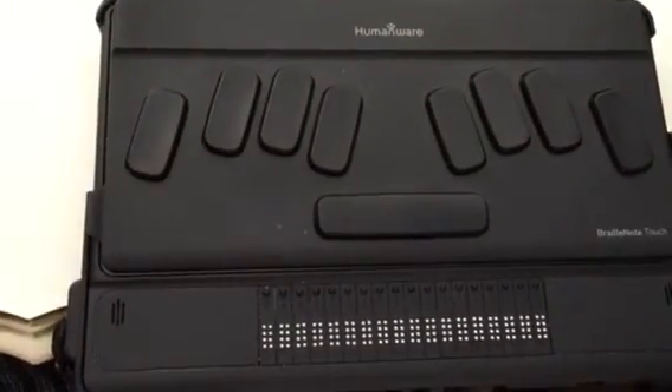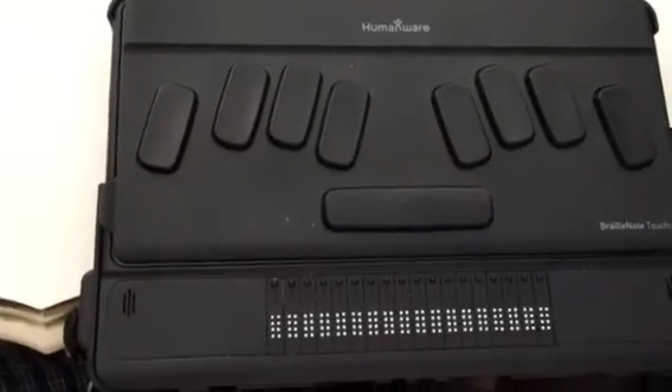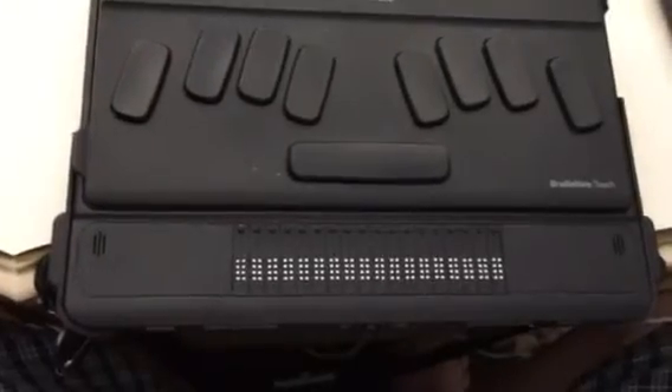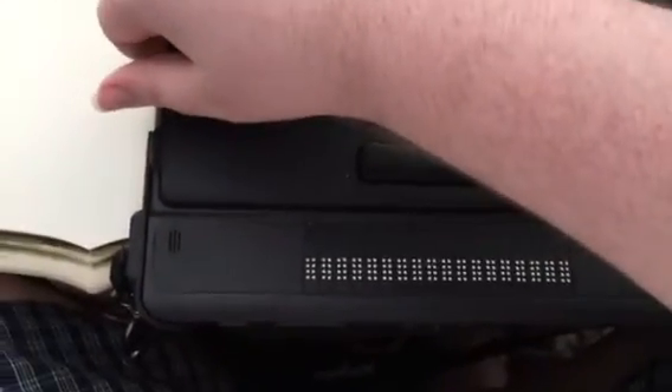Which works well, definitely works well. So to unlock you have a couple of different methods. One of them — well, first you always need to press the power button to wake up the tablet.